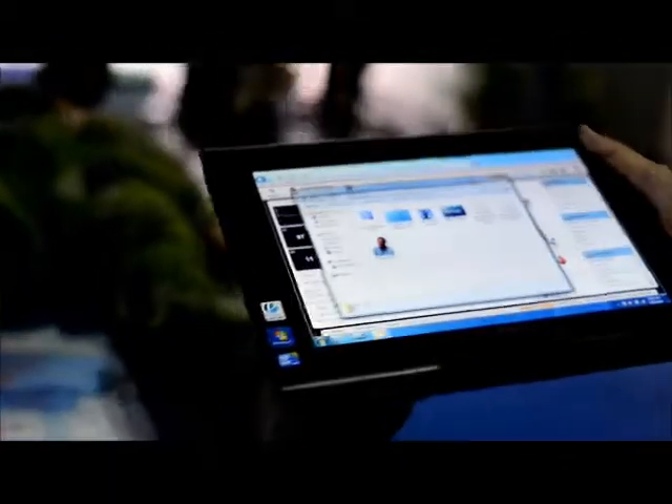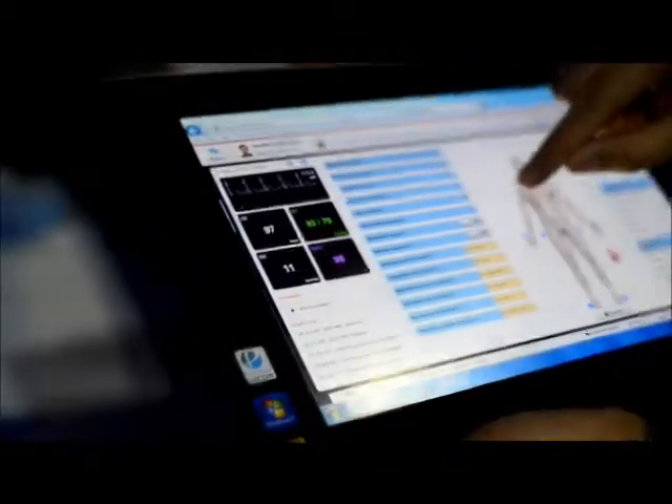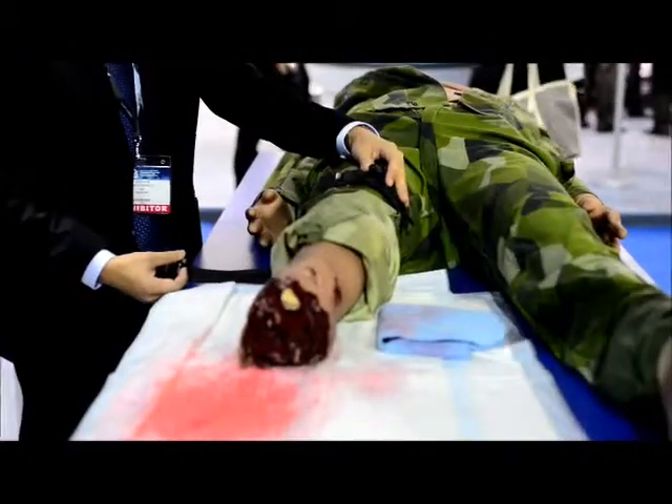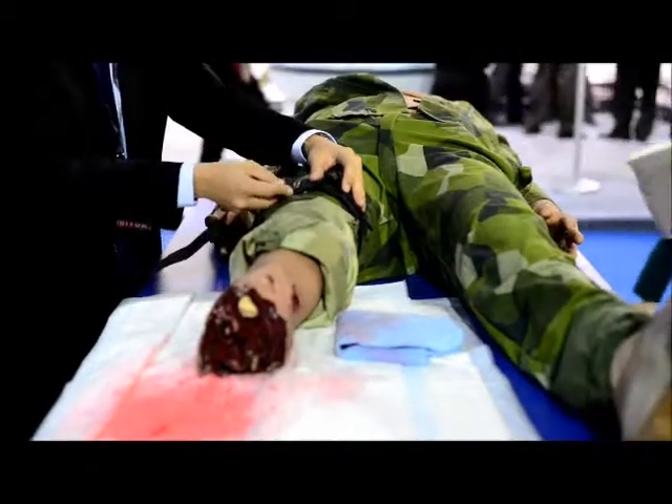Right now we are going to simulate a trauma injury where there is a bomb blast and a right leg amputation. With the software the instructor will be able to simulate the arterial bleeding just by a simple click of the button. Right now you will observe on the right leg the simulator is pumping blood.